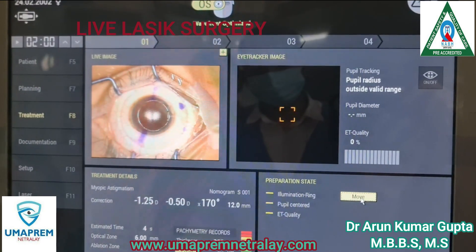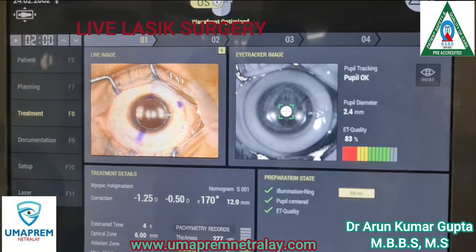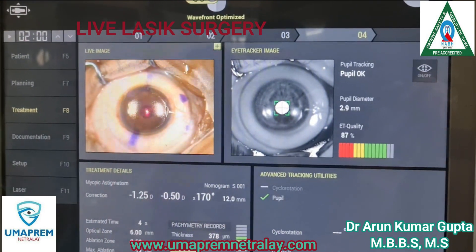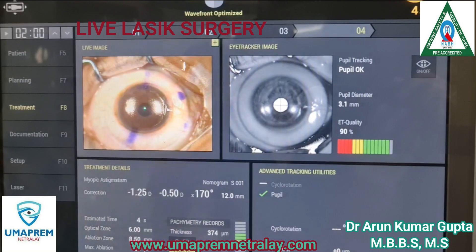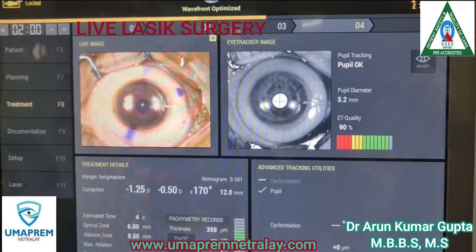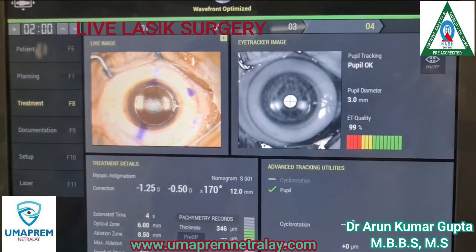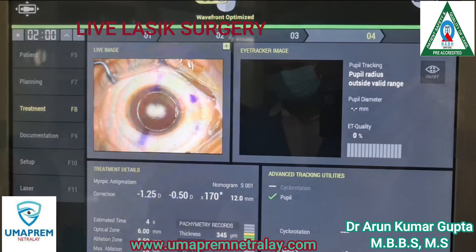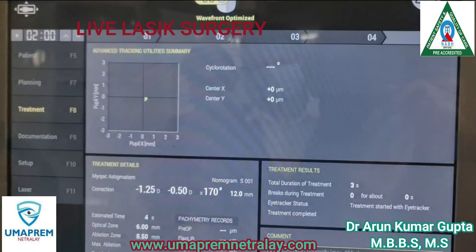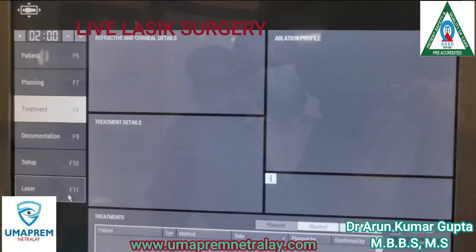After drying the corneal bed, we start the laser procedure. Now laser is completed. Then we wash the corneal bed. And here we see the laser is perfectly done.